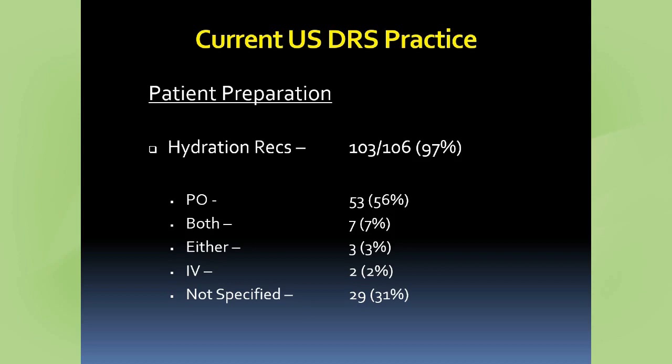But this can give you an idea where your practice falls in accordance with your peers. You can see there's still a small percentage that IV hydrate all their patients. Not many, but just those 2 institutions. There's 7, though, that actually do both. They'll give oral hydration and then they'll IV hydrate during the course of the exam. Again, I'm emphasizing that it's not wrong. I'm just emphasizing, what's your practice compared to your peers, so you can get an idea.